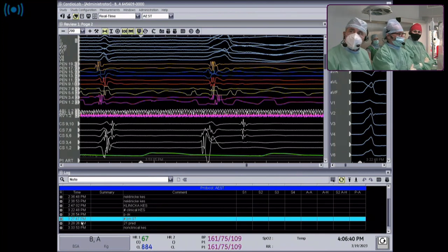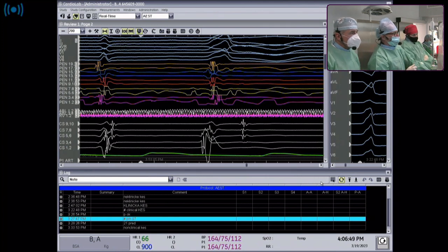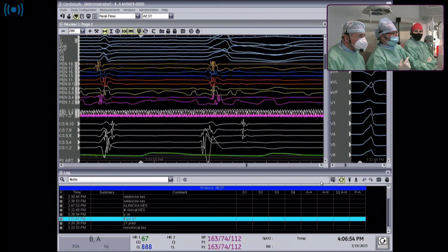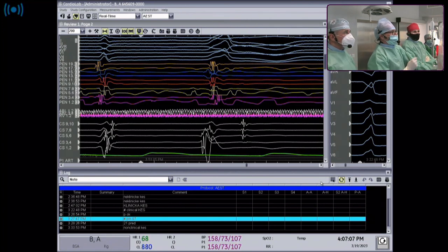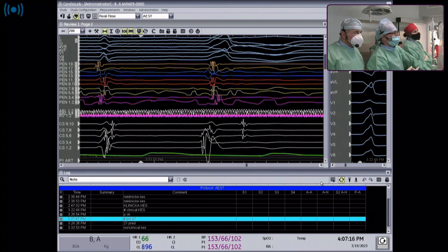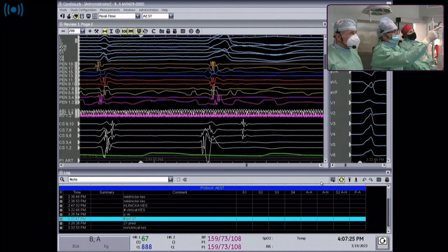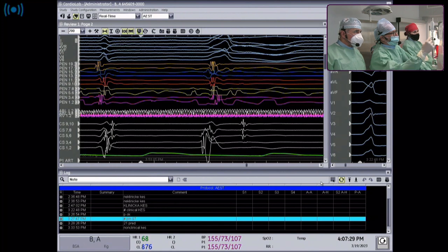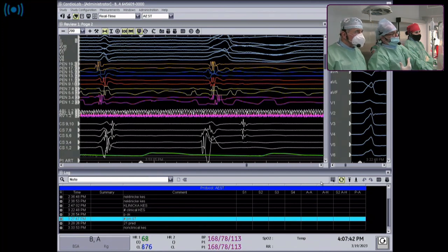On CARTO the activation time is much earlier at the proximal aspect of the AIV. We then looked at venograms to find branches of the AIV going intramurally. We found a vein branch taking off right at the second-to-last electrode from the EP star catheter, right between electrodes 3-4 and 5-6 of the decapolar - a very good candidate vein to map.